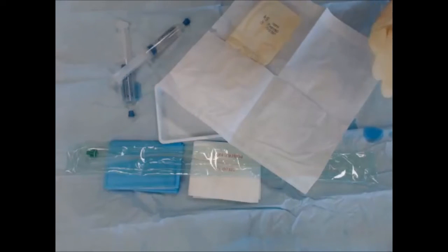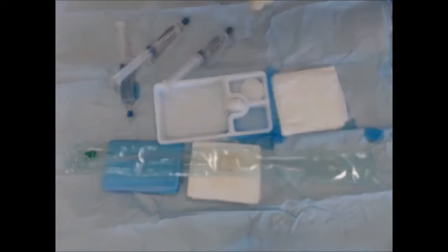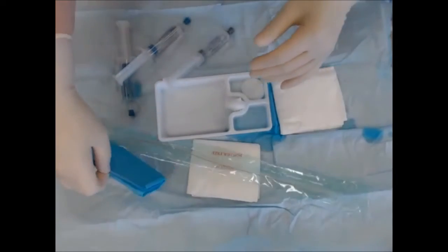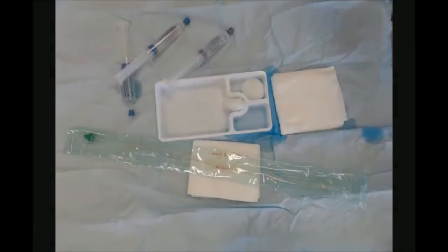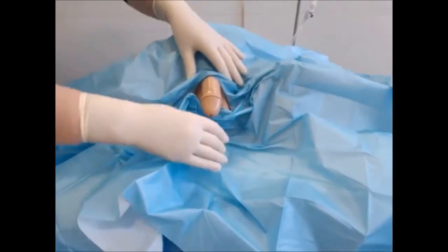It's much easier to catheterize with two hands than with one, so this is the point we change our gloves. Once the gloves are changed, put on the fenestrated drape. When using a drape, move away from your sterile field so you don't contaminate it. Shake it out, place it over the patient, and close off all the area that has not been cleaned. Then you're ready to go.